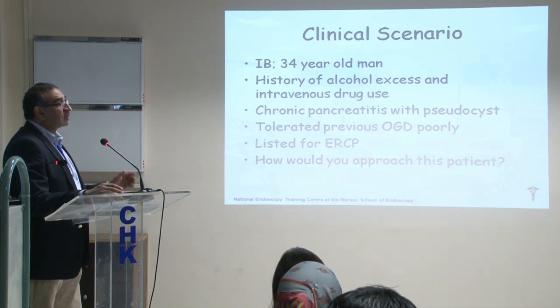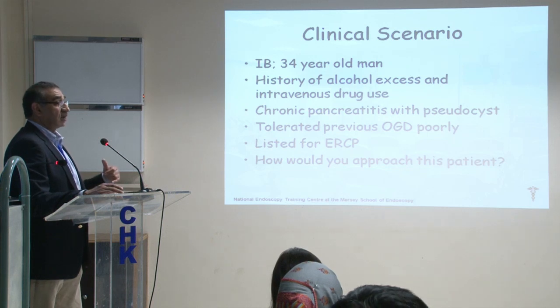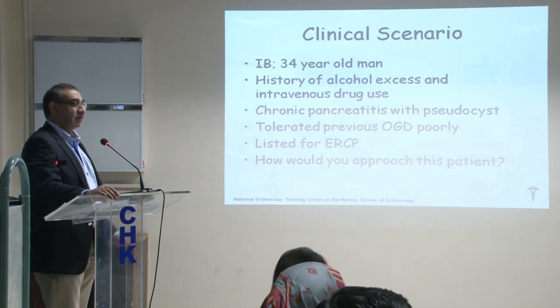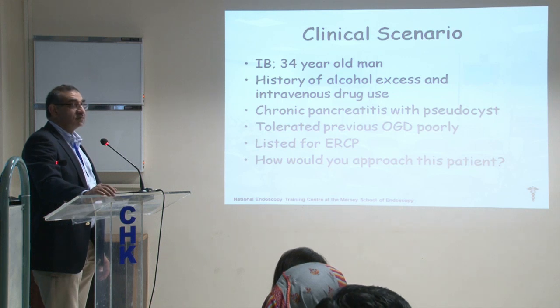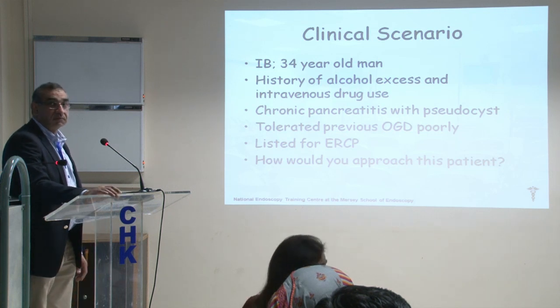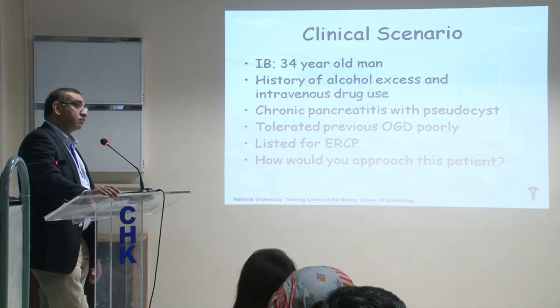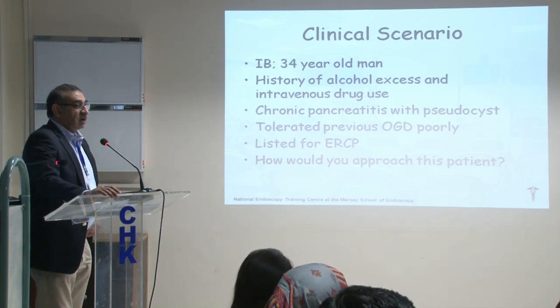With ERCPs we are a bit more liberal in sedation, but as I said, if we require heavier sedation, then I would do it under GA. That is standard practice with us. I personally feel that if I had the choice, I would do all ERCPs under propofol. Life becomes very easy. The last thing you want to do when you're doing ERCPs, especially if they're even a little bit complicated, is to worry about whether the patient is talking to you and what's happening to the lungs. I really don't want to know that. But obviously that's the world where we live.